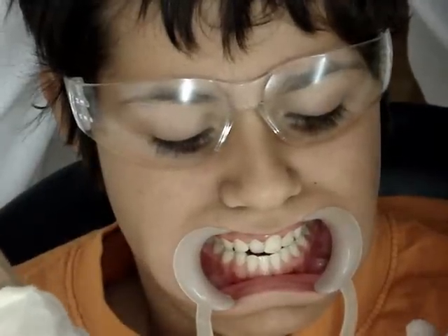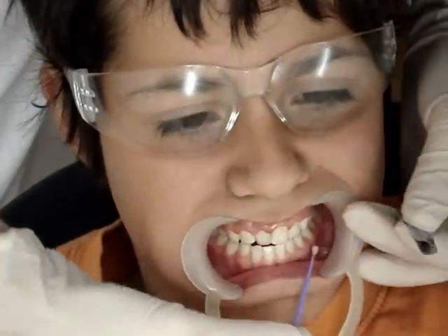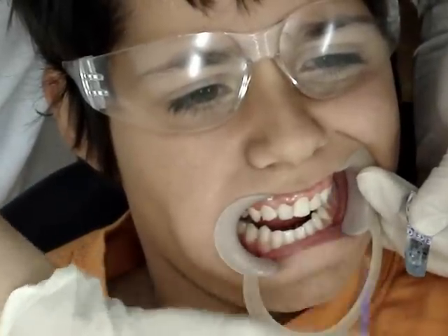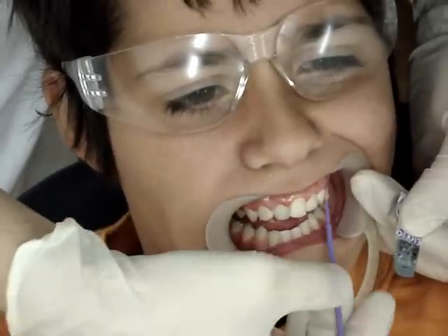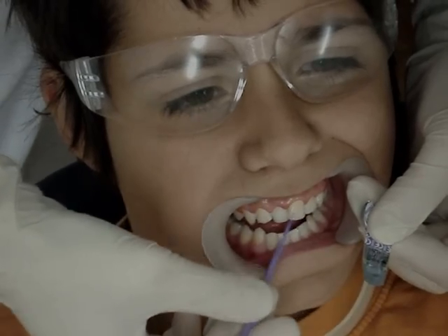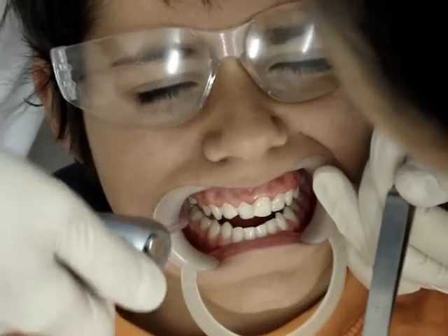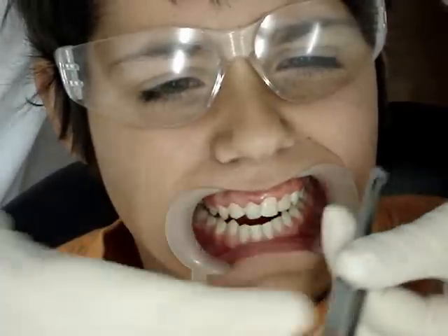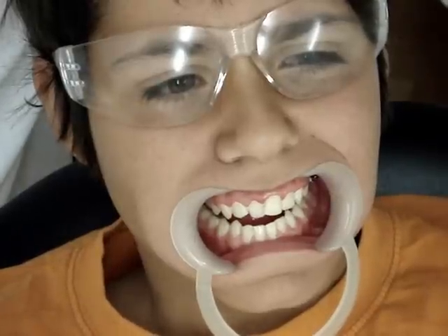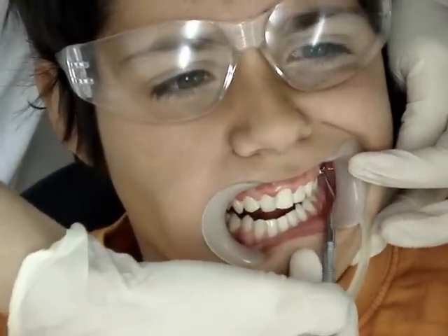We're going to place brackets that have tubes — they're just brackets with tubes called bondable tubes. Here we go. Let's paint this on. I'm going to use a flat plastic to cling around the first bracket and to adjust it in place.